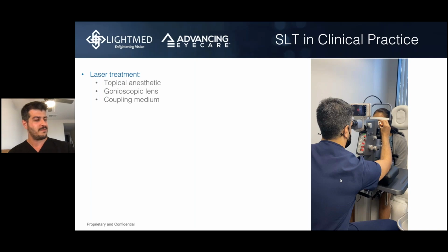Perfect. Thank you so much. Okay, so back to some clinical questions. If you see a very lightly pigmented trabecular meshwork, would that dissuade you from SLT and push you towards drops?